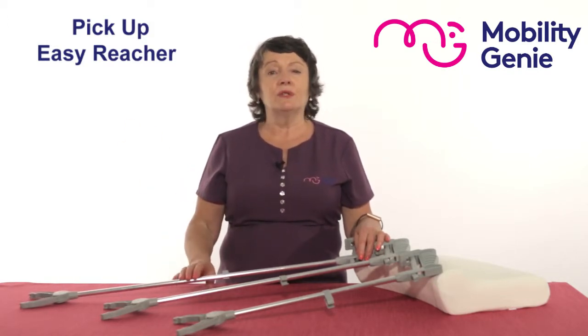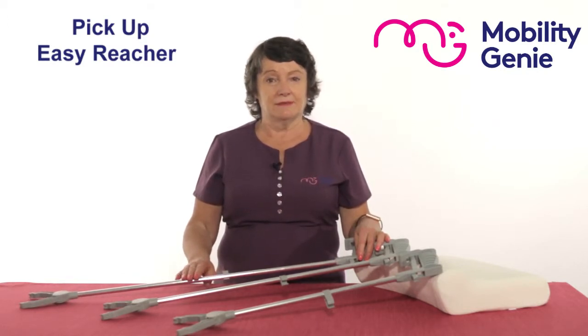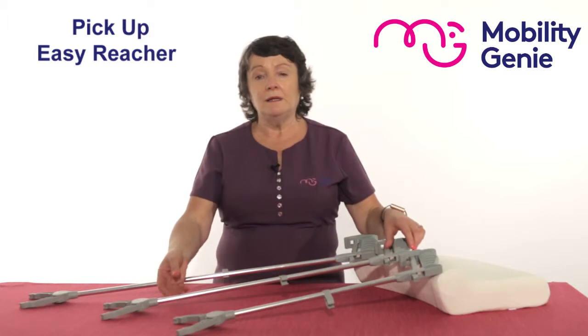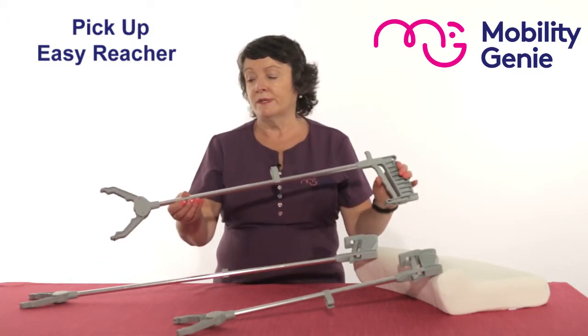In particular for somebody who may have had their hip or their knee replaced and they're told not to bend, these would be ideal in that situation. For me, because I'm 5 foot 2, the middle one — the 30 inch one — would suit me perfectly.